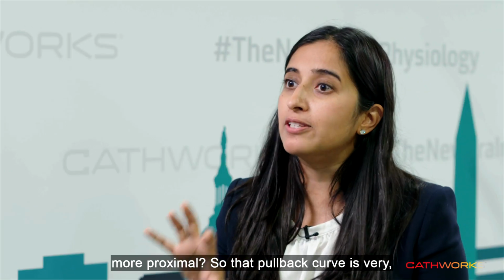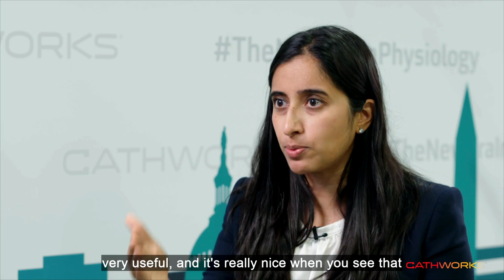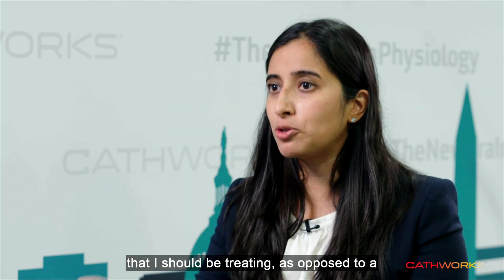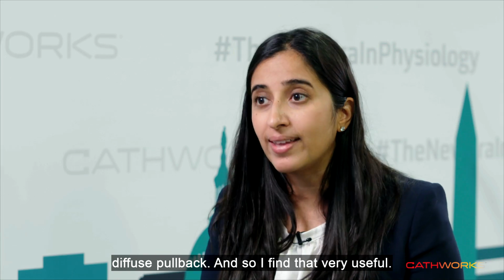So that pullback curve is very, very useful, and it's really nice when you see that discrete drop, you know that's a discrete lesion that I should be treating, as opposed to a diffuse pullback. And so I find that very useful.